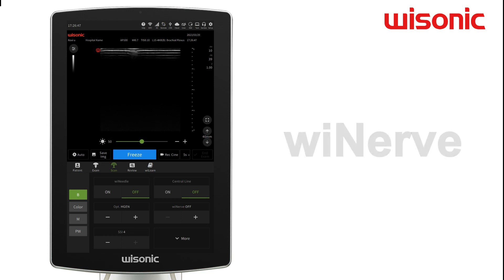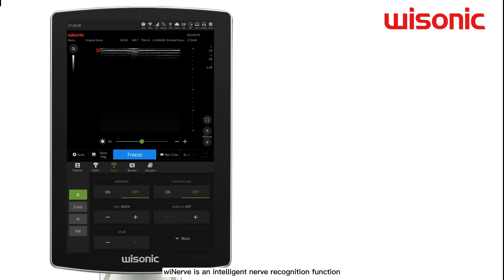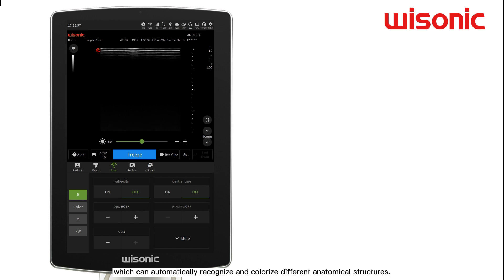wiNerve is an intelligent nerve recognition function, which can automatically recognize and colorize different anatomic structures.